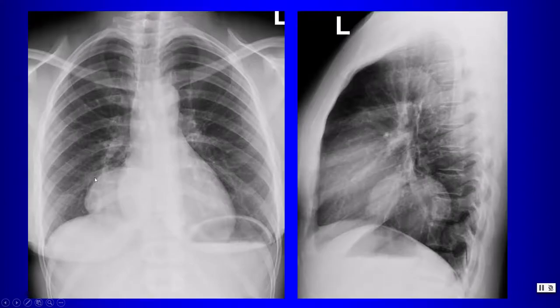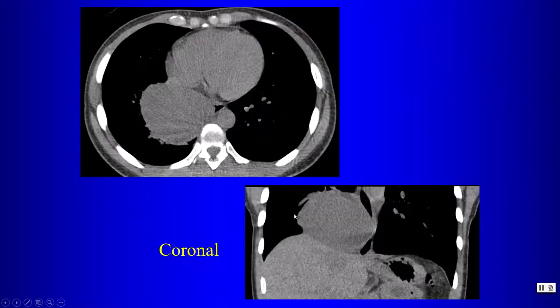Another example: a large round mediastinal lesion with fluid attenuation on CT, in contact with the esophageal wall. This again was an esophageal duplication cyst.